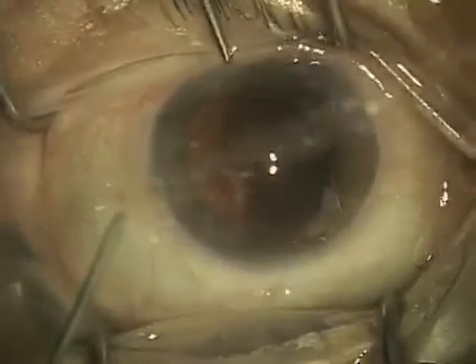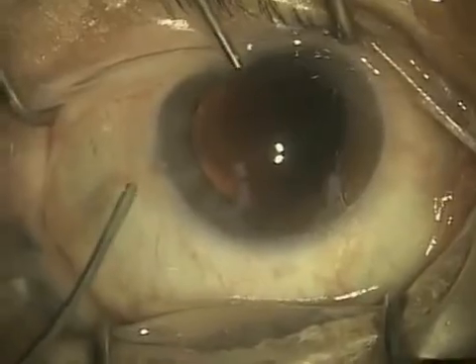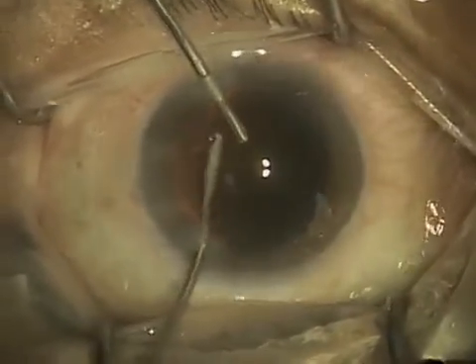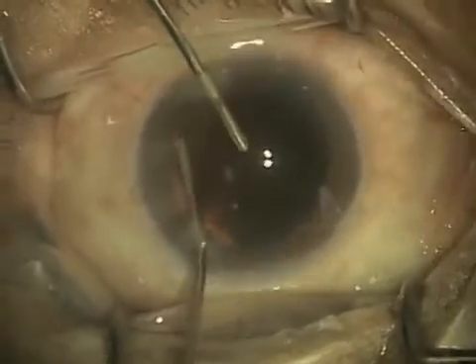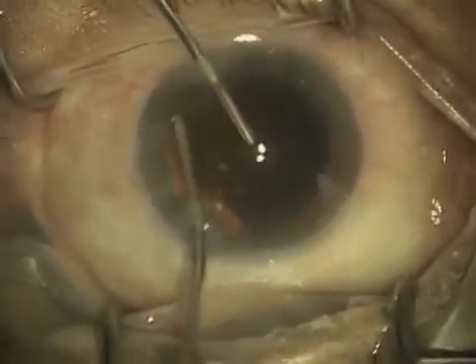Now the eye is ready for some additional viscoelastic, so I'm just going to have the patient look straight ahead at the light. Oftentimes as the view clears up they start looking around, so I just informed the patient to continue to look straight ahead.